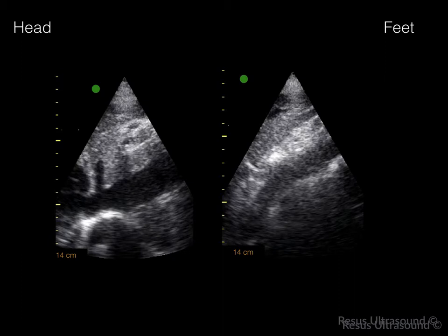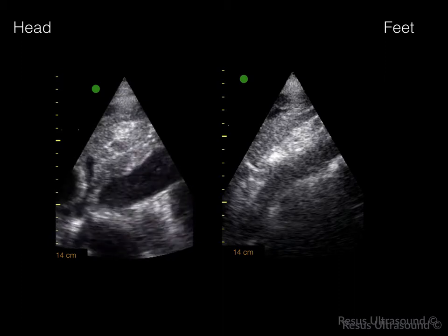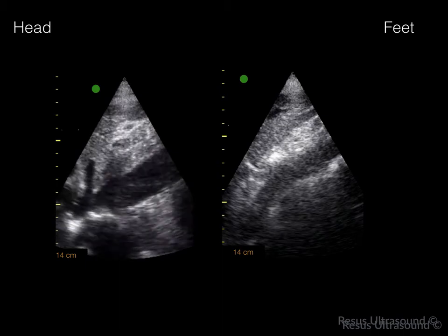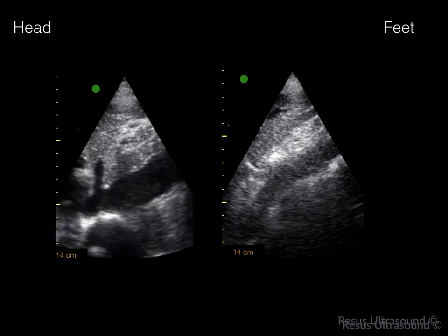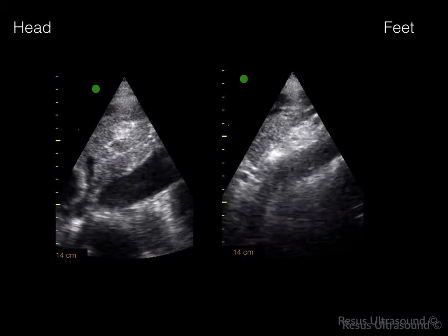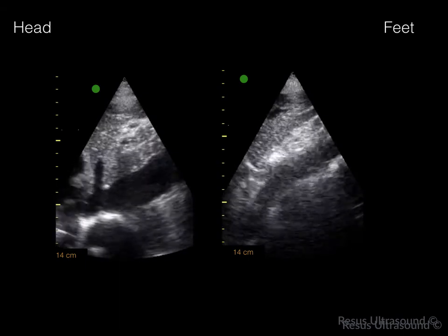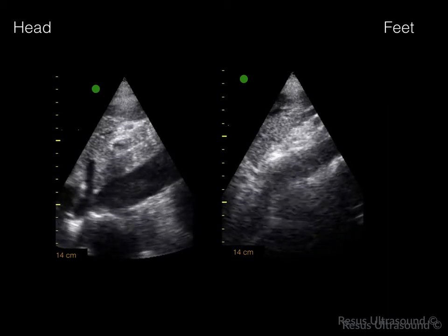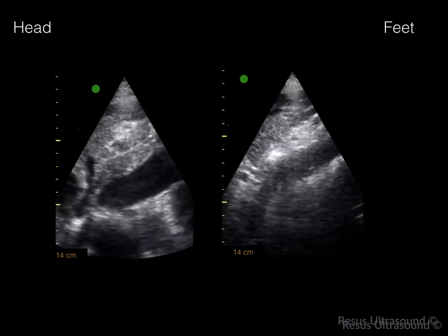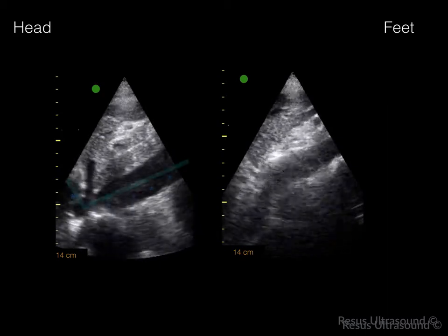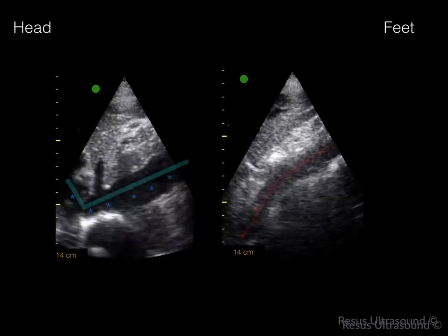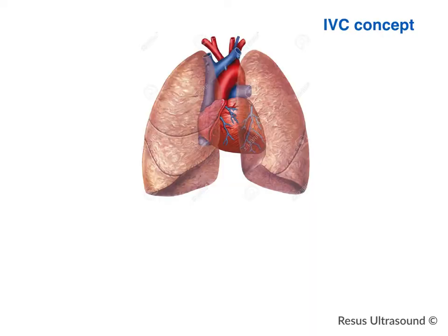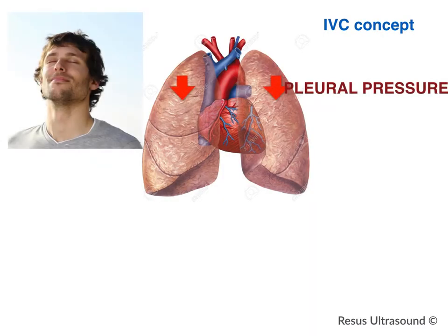This is a very important point: sometimes you confuse IVC with the aorta. The IVC would look like a checkmark and varies by inspiration. The aorta is actually downward toward the patient's back, as you can see here.